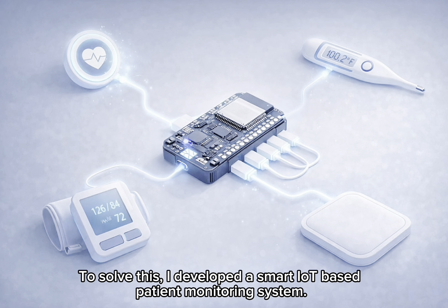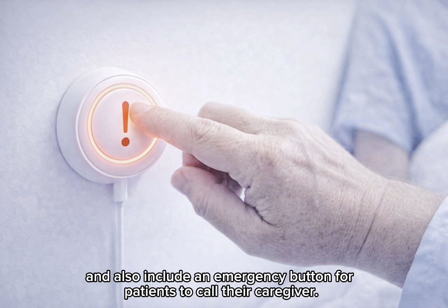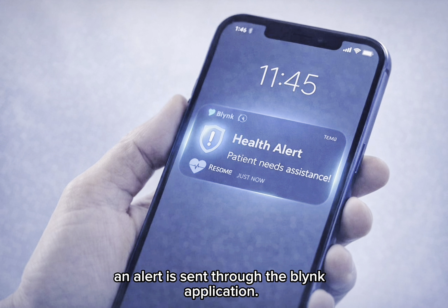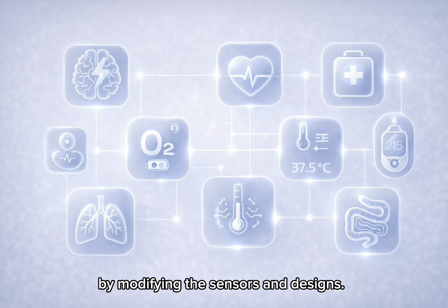To solve this, I developed a smart IoT-based patient monitoring system. The system measures heart rate, body temperature, and room conditions like temperature and humidity. It also includes an emergency button for patients to call their caregiver. If an abnormal heart rate is detected or the button is pressed, an alert is sent through the Blynk application. This system can be adapted for different diseases by modifying the sensors and design.